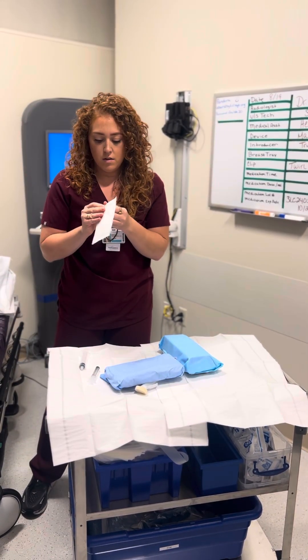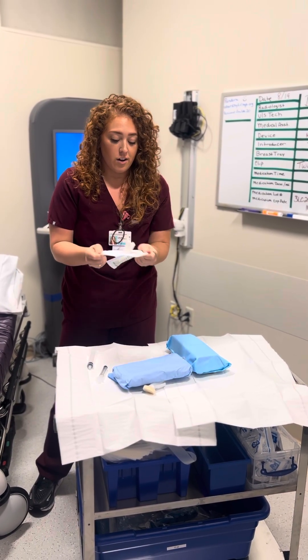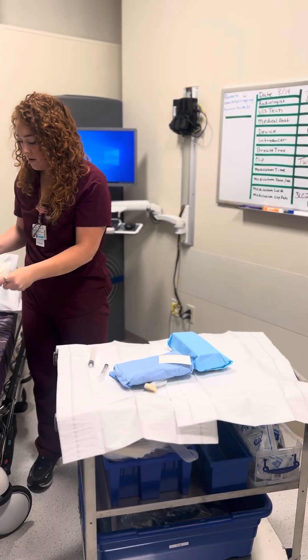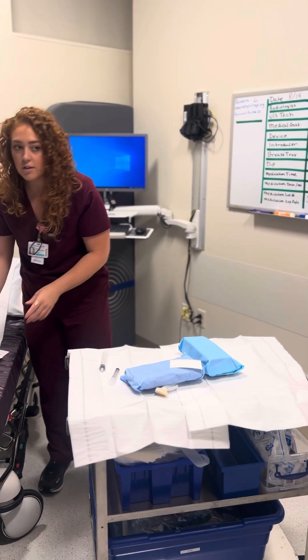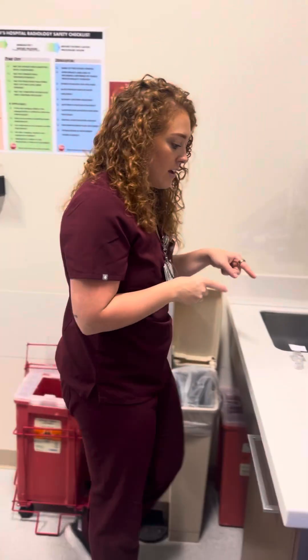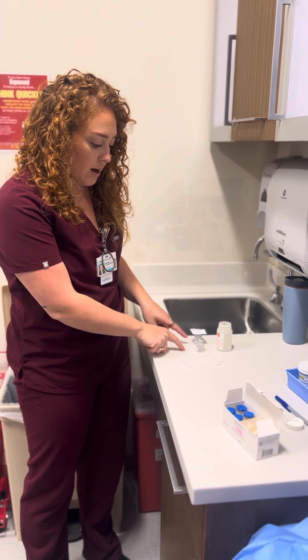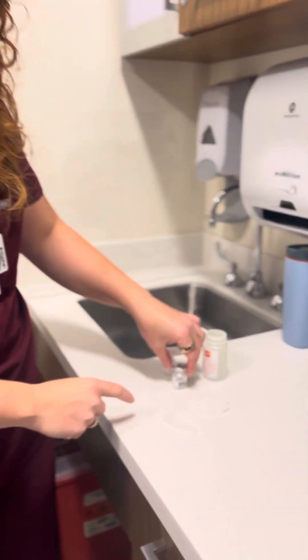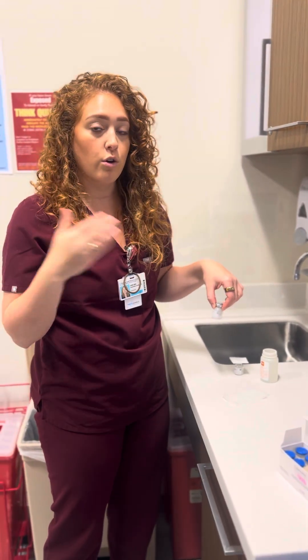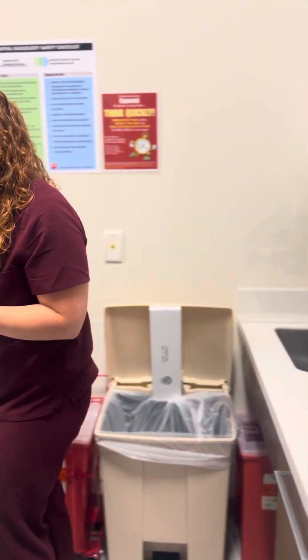And I have this little Telfa piece — I'll show you where to put that. Now I'm going to glove up. The prep that Heather did before we started: we have our lidocaine here and ready, and our saline solution open. For breast biopsies here, we have two 5 ml vials of lidocaine. We want to make sure the lidocaine batch and expiration date are written on the board so you can document it later. I have them uncapped and the saline open — that's going to be important for when I am sterile.